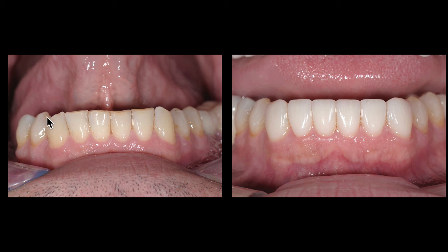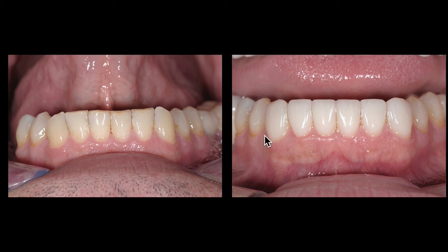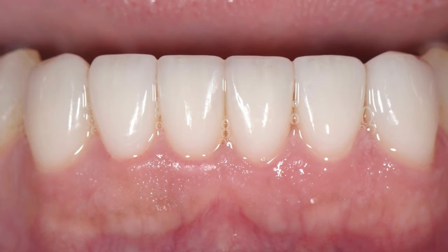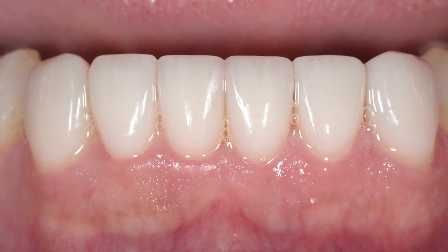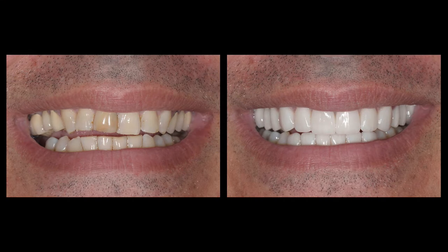You can see the change in the cuspid — this was a dramatic change to improve the lateral guidance and prevent the patient from having group function on that side, especially with the implants being placed. Here are the veneers again. These are feldspathic porcelain veneers, layered ceramics made by my ceramist Harold Heindel.